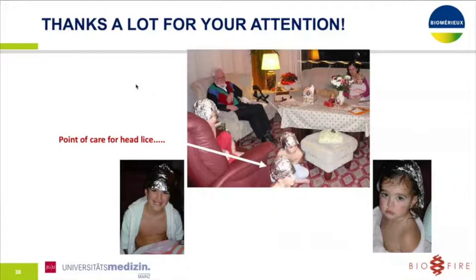The stool sample was tested. So as I said, we test all three kinds of accessible samples: stool, respiratory tract, of course, and CSF. But of course, norovirus is only detected in the GI panel, and we tested it in the stool sample. All right. Okay. Thank you.